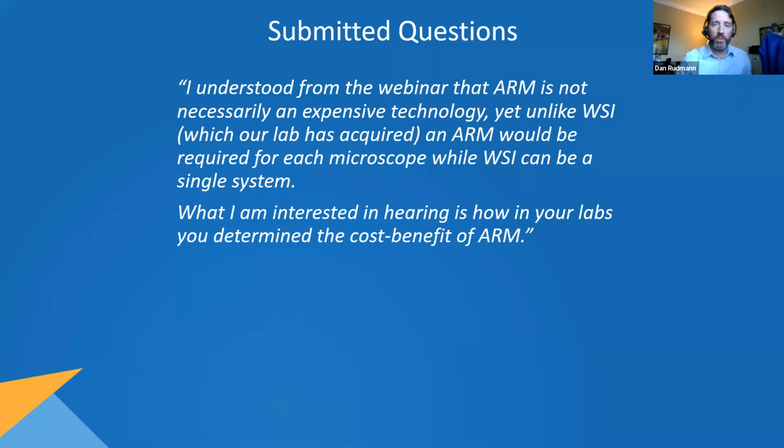But ARM is cool because you still have the light microscope, like a dual-headed scope in a way, but with a computer, and so it's kind of a nice transition and we can learn a lot from it too, right?